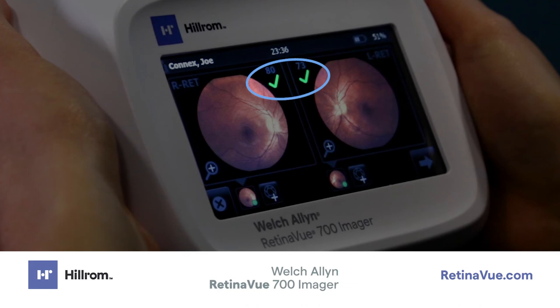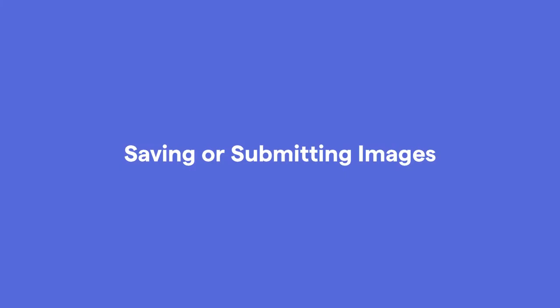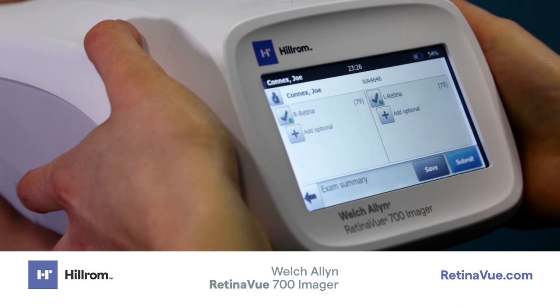It is possible to take a second image by clicking on the plus image icon on the screen, which will bring you to the start screen to repeat the image acquisition sequence. To save or submit the images, proceed to the exam summary screen and select Submit. For additional information on imager operation, consult the directions for use at RetinaVue.com.